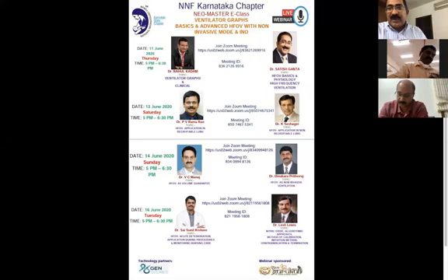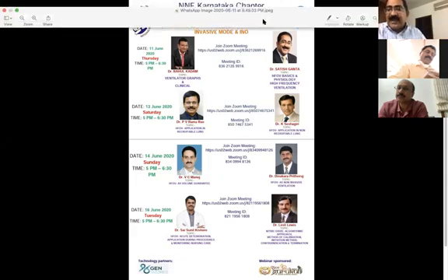Okay. And as you rightly said, critical opening pressure or the critical closing pressure, it's not in the textbook. I'm speaking to some of the students who come and say, sir, high frequency is fantastic. It is very, very advantageous. You directly oscillate this child on the deflation limb. No, sorry, boss, it doesn't work that way.